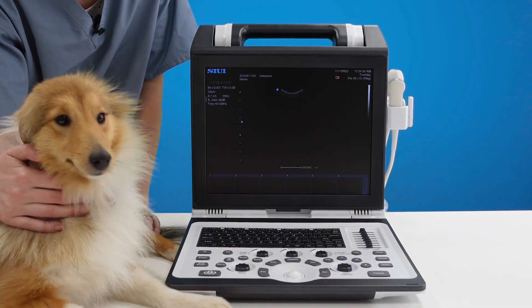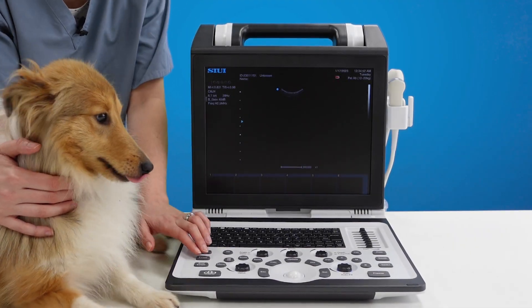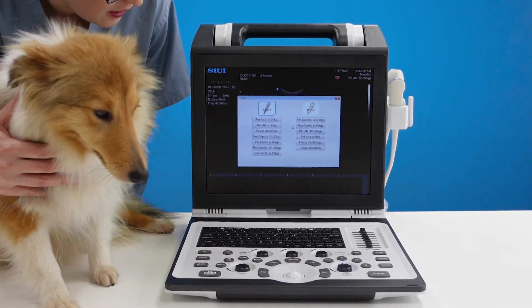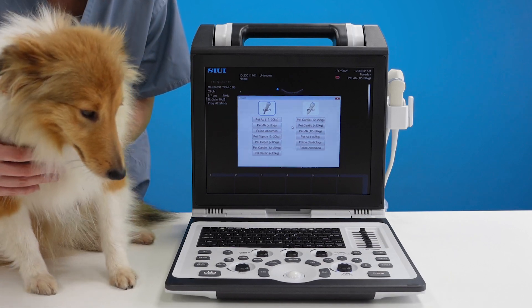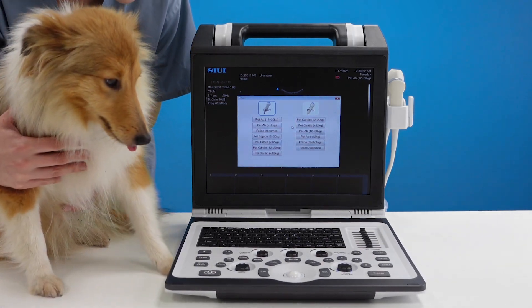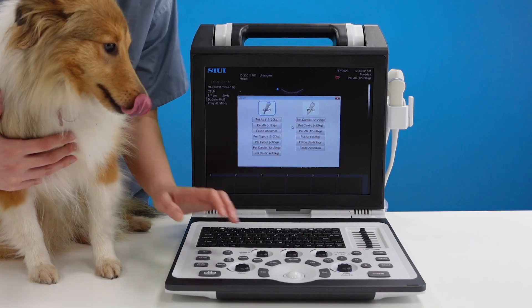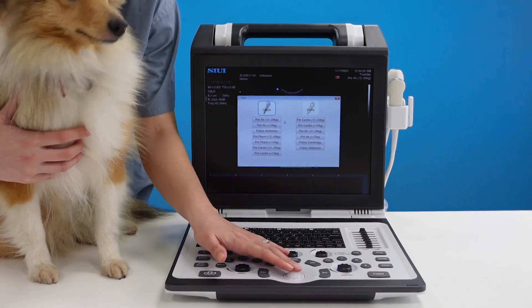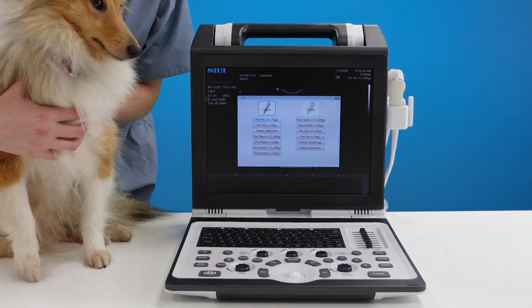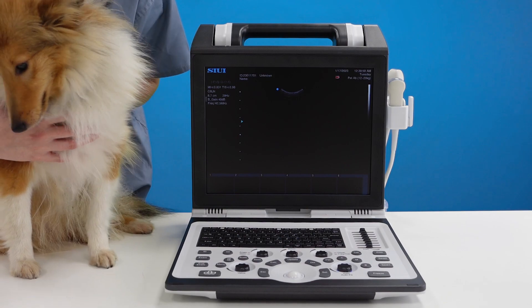To begin a new examination press the exam key and select what kind of examination you want to perform. I'm going to start with an abdominal examination so I'm going to go to pet abdomen and press set.